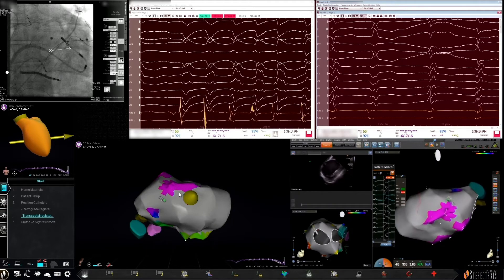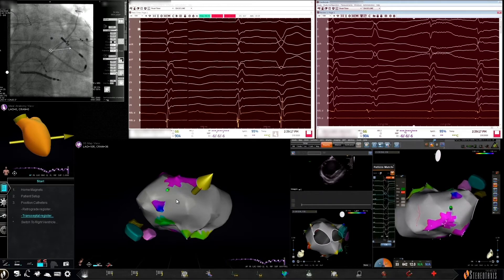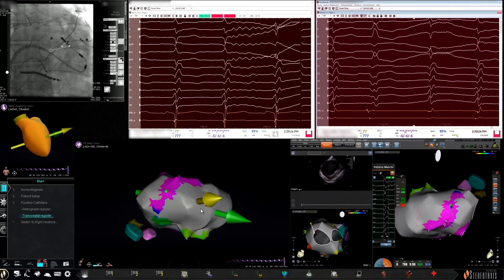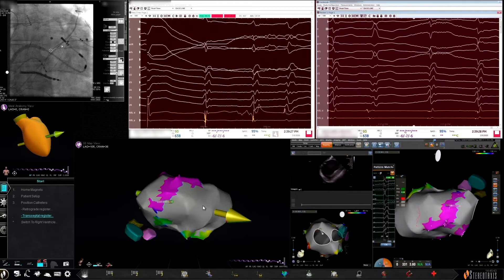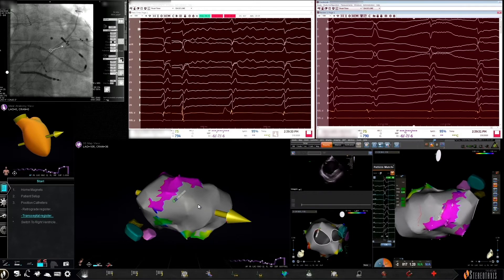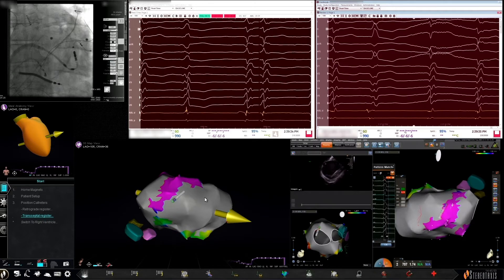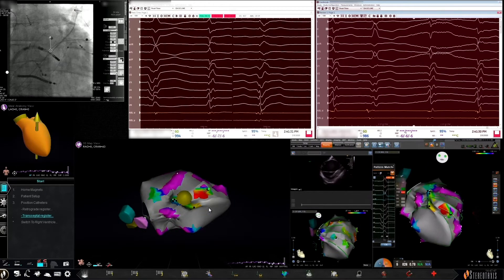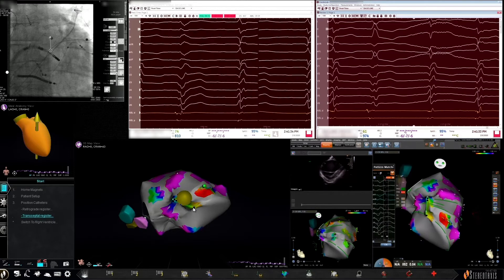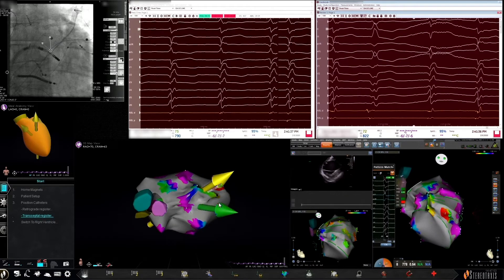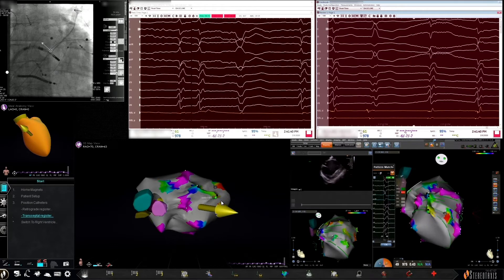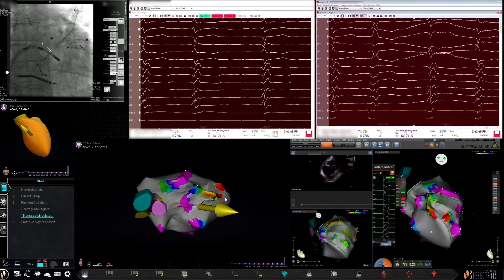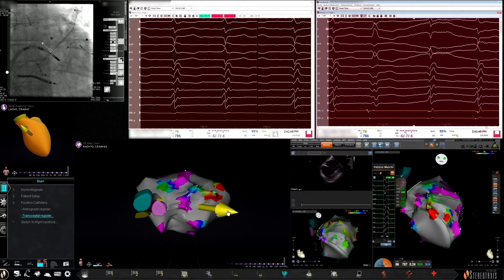Despite the patient's enlarged left ventricle, mapping at the basal portions of the heart under the valves is not a potential issue with the use of an RMT catheter, but can sometimes be a struggle regardless of transeptal or retrograde aortic approach in a very dilated left ventricle. Late potentials, as identified by little black dots on the map, also indicated areas of interest with the plan to target later for ablation. Delineation of scar borders is initially performed with the RMT catheter, but will be further detailed with the Pentaray catheter next.